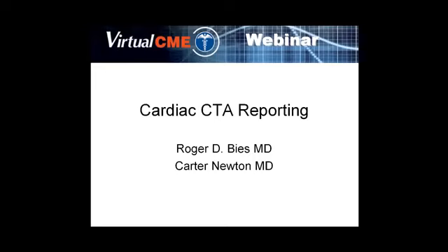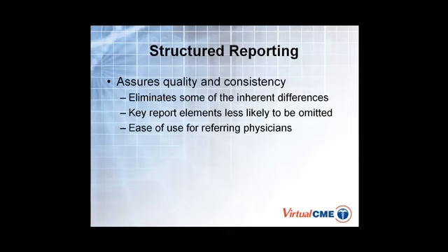We had some questions on the previous webinar regarding how to report cardiac CT angiography findings. So we presented a brief slide presentation on that. Structured reporting is really essential for doing these exams.